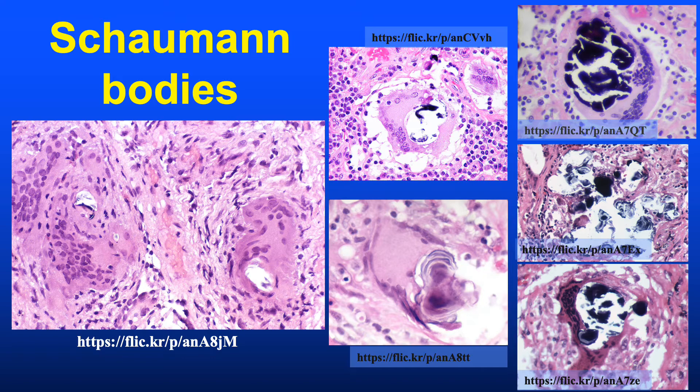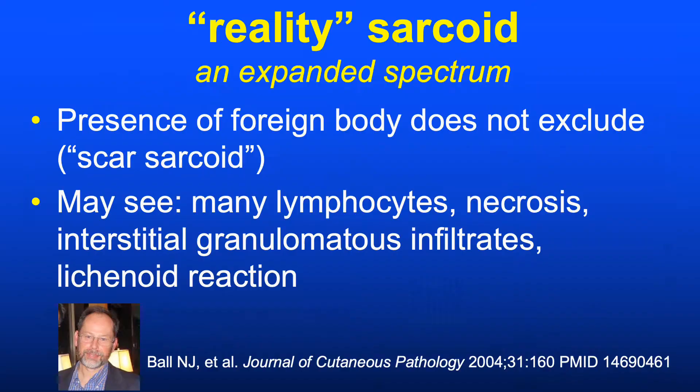The second so-called sarcoid body is the Schaumann body, named after Dr. Schaumann, a Swedish dermatologist — although sources indicate it was first described by Dr. von Schüppel, a German pathologist. This is a calcified, multinucleated histiocyte, shown here in multiple images courtesy of Dr. Yale Rosen of Long Island, New York, who also kindly uploaded the images of the asteroid bodies.